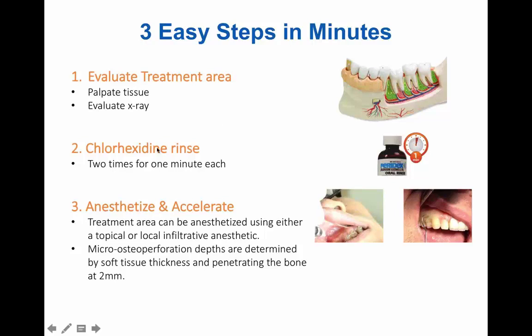Now, before the patient starts the procedure, you'll want them to rinse with chlorhexidine 2 times for 1 minute each, and that's merely as a precaution to reduce the oral bacteria. Since you are going to be making a perforation in the bone, we don't want the oral bacteria entering the internal bone.